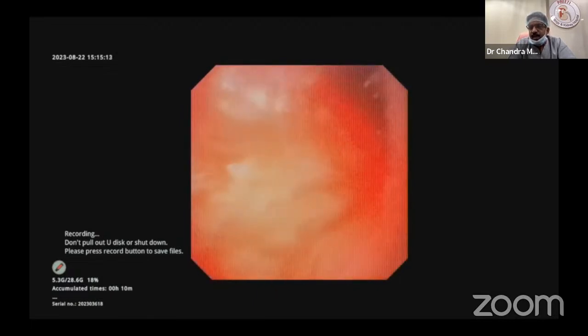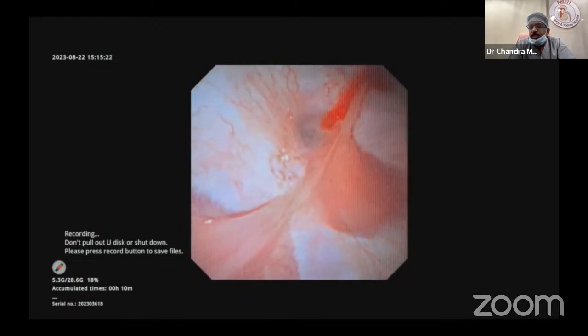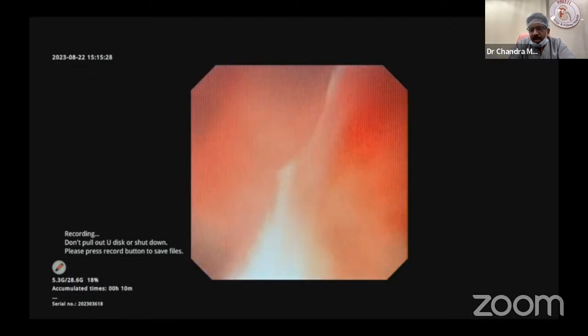See, so much time I am wasting. Here actually the contrast might have been shown. It is not shown. I am repeatedly going and showing all the calyces out of enthusiasm. See how the upper calyx, a compound calyx, is there. So these are all very narrow angled. At the end, if you want to inject contrast.